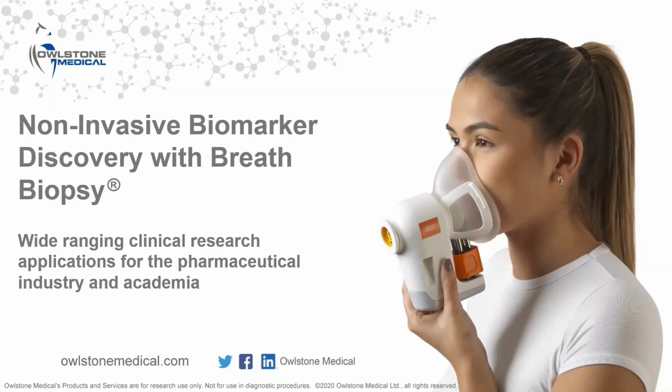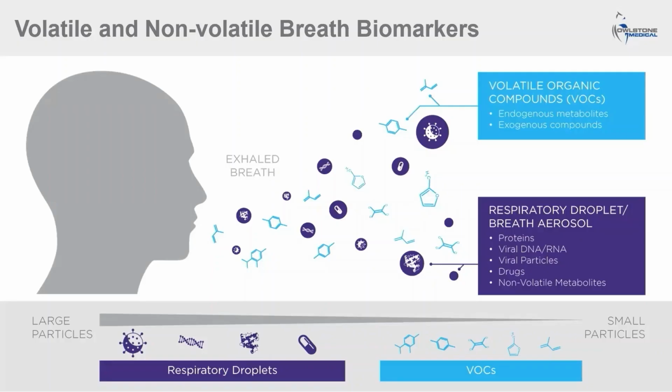Before I present results from our non-invasive biomarker discovery program, I'd like to reiterate a few points. As previously mentioned, breath is a rich and complex mixture of volatile and non-volatile components. The volatile component of breath contains VOCs that are produced by metabolism in the body and transferred through the blood to the lungs, where alveolar gas exchange allows for their release in the exhaled breath. Non-invasive profiling of breath VOCs can provide a source of useful biomarkers with clear association to the body's metabolism.